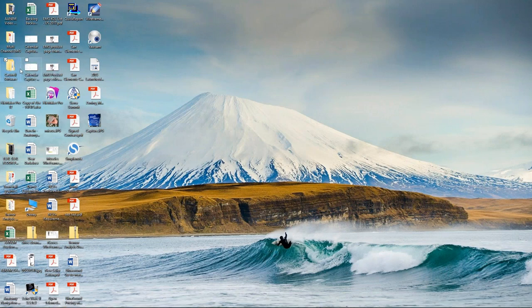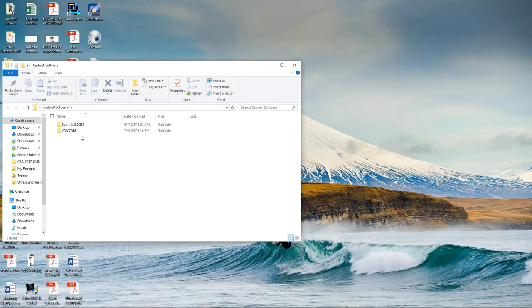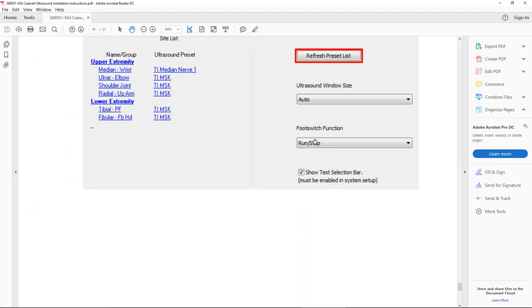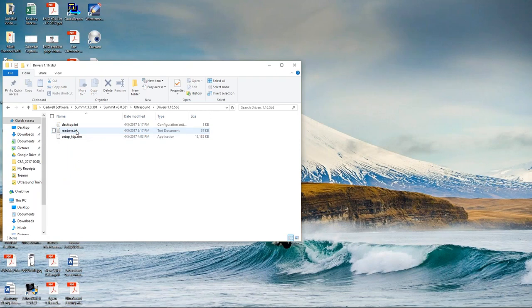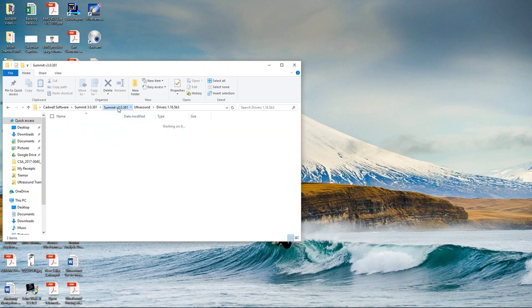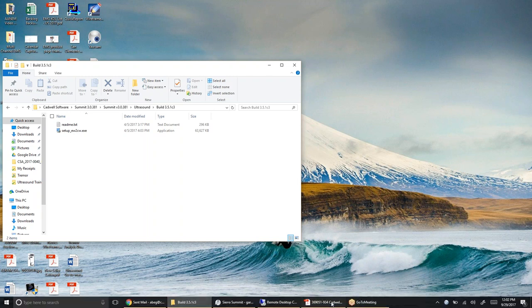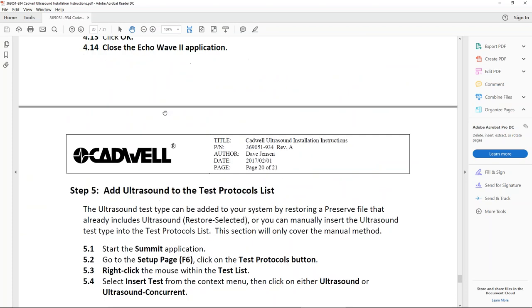First, I'm just going to bring up the software install and go over that really quickly. In case you need to install this on someone else's computer, just go into the Summit installer. In there, there's an ultrasound folder — make sure you follow the instructions here. What you're going to do is install the drivers first. Open this up and run this setup folder to install the drivers. Then you want to install build 3.5 and just run that installer. Once those two things are done, you should be good to go.